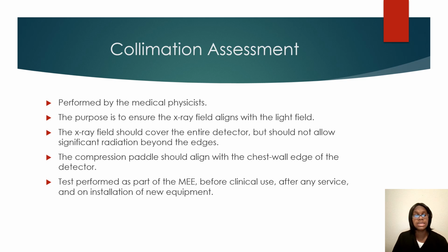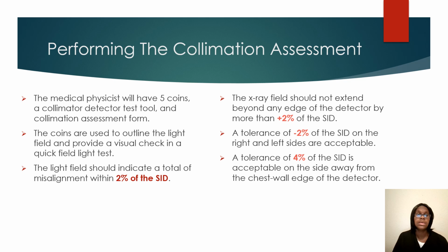For your collimation assessment, this is performed by the medical physicist. The purpose is to ensure that the X-ray field aligns with the light field. The X-ray field should cover the entire detector, but should not allow significant radiation beyond the edges. The compression paddle should align with the chest wall edge of the detector.